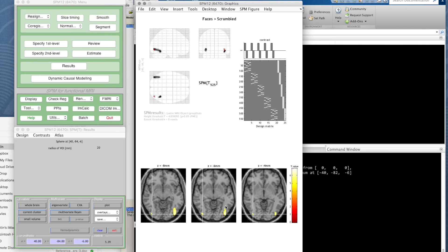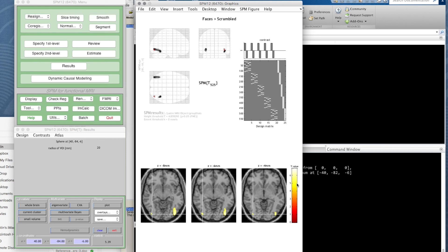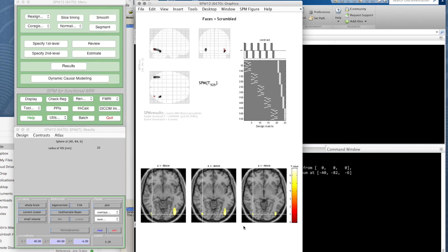Here we're overlaid on slices. This gives us three transverse slices showing this particular slice here, two millimeters apart. Note the color bar here of t values going from sort of red at zero up to white at seven. Remembering that our height threshold is nearly five, all the statistically significant voxels are going to be those which are very bright yellow or white anyway. What you've got to remember is this overlay is somewhat misleading because it's just some random person's brain that's been warped to the template.